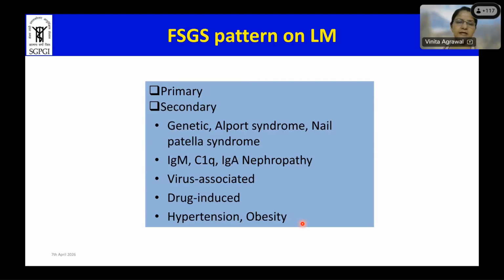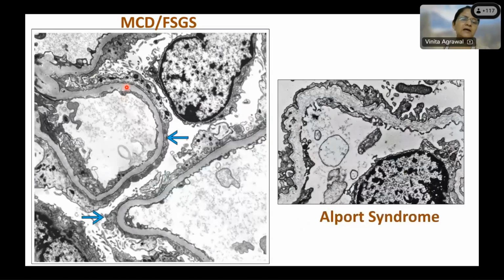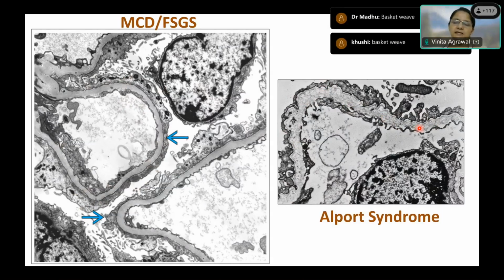So you talk about podocytopathy. What is podocytopathy? There is complete podocyte foot process effacement. The podocytes become completely flattened, and this is what is known as podocytopathy. There is condensation of the cytoskeletal filaments at the base. Whereas in Alport syndrome, you have this. What is this known as? Anybody? What is this in Alport syndrome? What happens to the basement membrane? What are we seeing? Bumpy, what do you think this is?